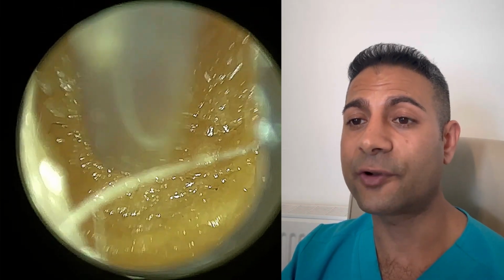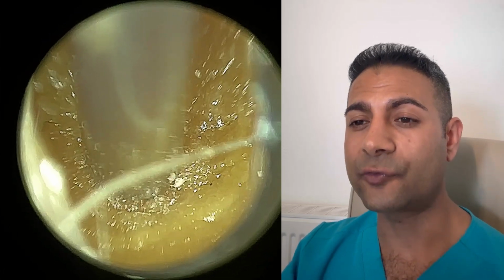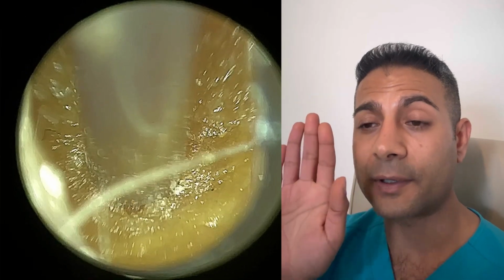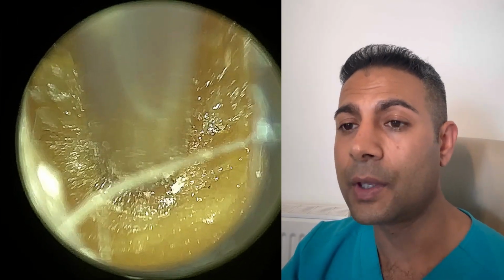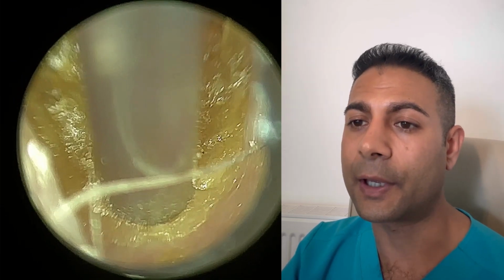And I have a really interesting case. It's of a patient who attended with a blocked left ear. And this soft consistency of wax was not only fully occluding the ear canal, but it was impacted and embedded right up against the eardrum. So whenever you work closer to the eardrum, it always makes the procedure a bit more complex.